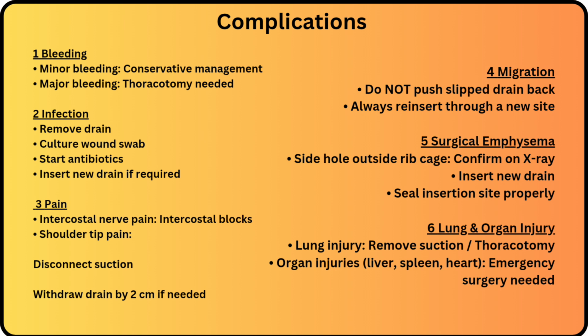Complications. Infection. If infection occurs, remove the drain, obtain a wound swab, start antibiotics, and insert a new drain if necessary. Complications. Pain. Pain from intercostal nerve irritation may need intercostal blocks. Shoulder tip pain often improves by disconnecting suction or slightly withdrawing the drain.